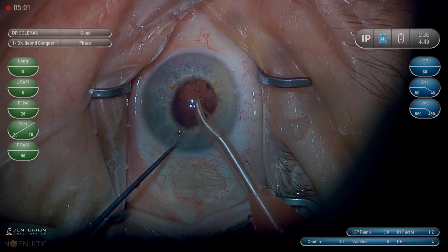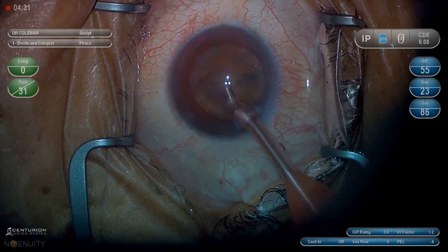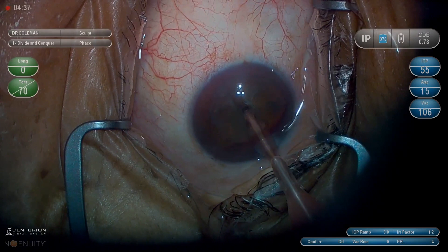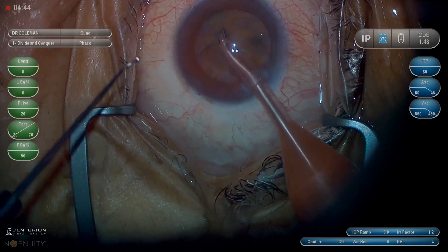This is a little bit of a small pupil, so I'm being careful and going to position zero — letting the pressure in the eye basically get to zero before I come out with the phaco. That prevents iris prolapse. That's a great trick in people with IFAS. Go to position zero. You almost never want to use position zero, but that's one case where it's really useful if you have an iris that's trying to prolapse.